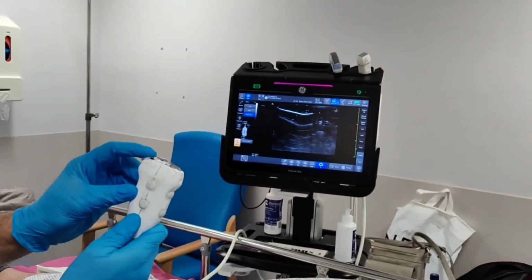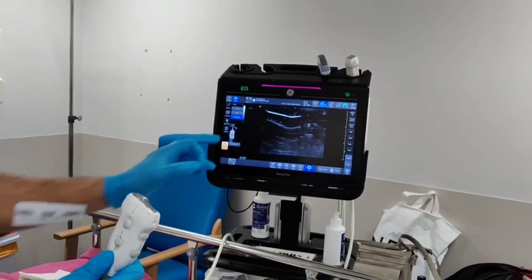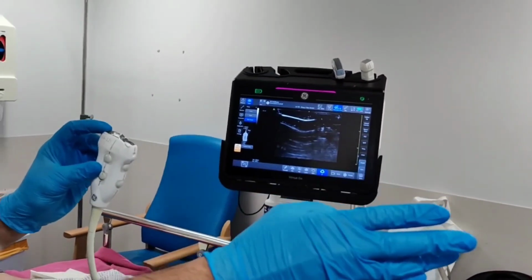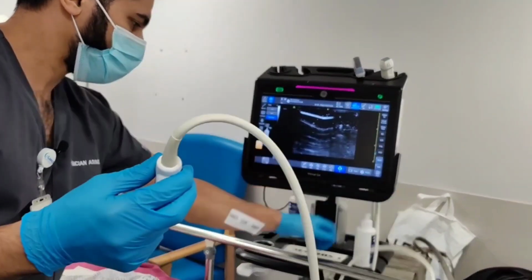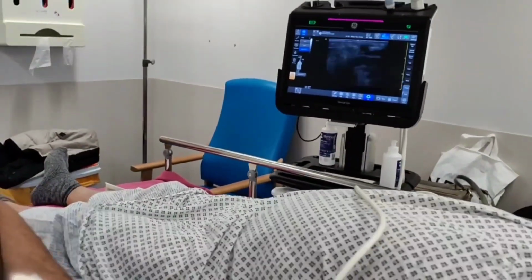I will then check the orientation on my probe. Okay, this by convention should be on the right hand side, so this side of the probe should be on the right to the patient or to the cephalic end. Once I've got the orientation, I then need to try to find a blood vessel. So a little bit of cold gel if I might. I've already applied the tourniquet, and here we go.